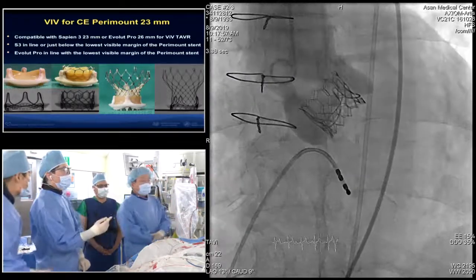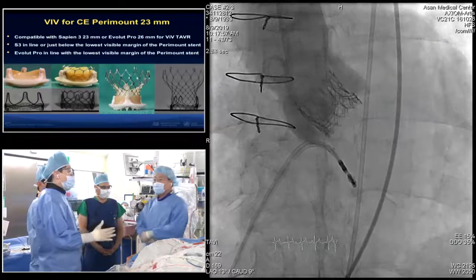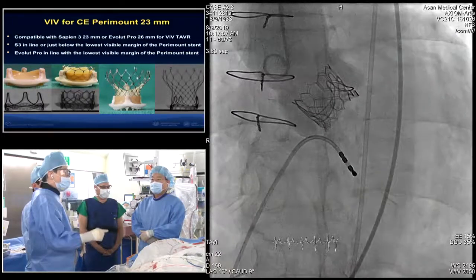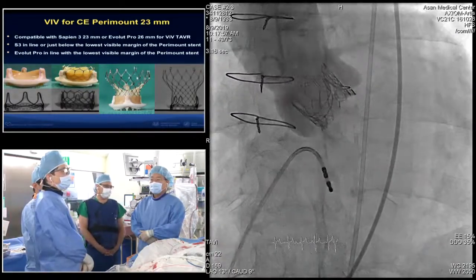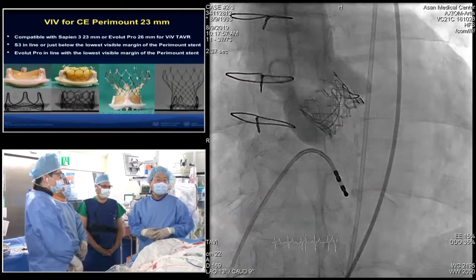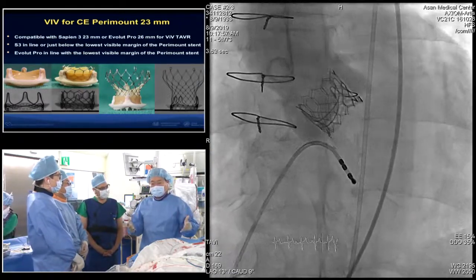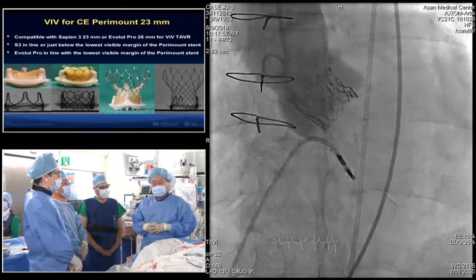I saw that your 2D echo shows a near normal size of the left ventricle. The end diastolic dimension was about 48, not so large. That's so large. Professor, diastolic at 48, right? Yes. You mean the AR event is relatively acute, or subacute? Right. We can guess that.